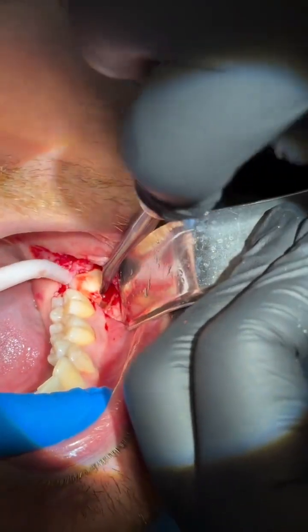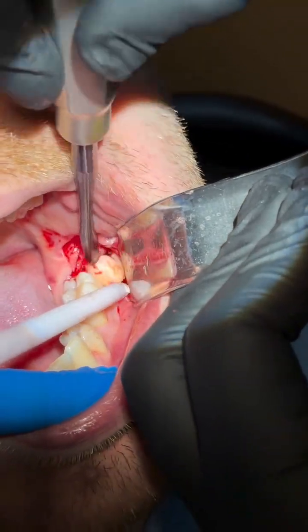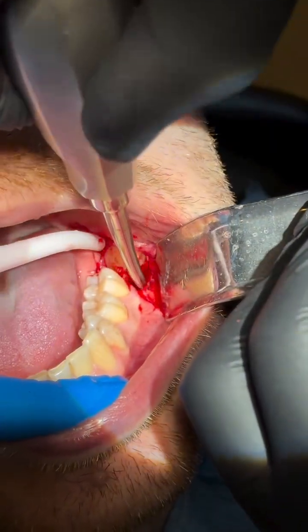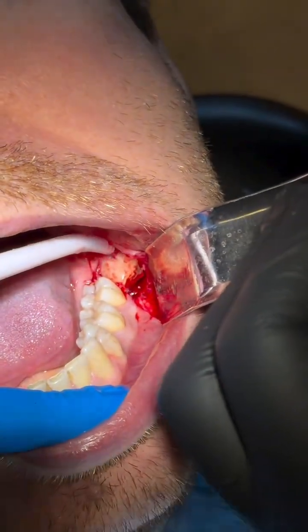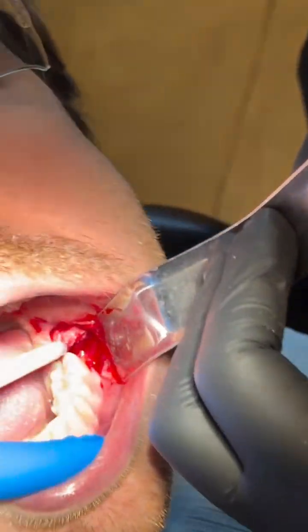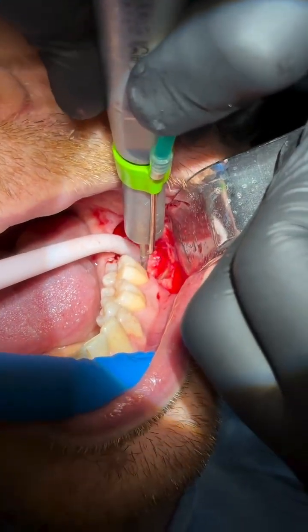Once the crown is broken, I remove the broken part of the crown. I'm using the Cryer's elevators here. I only use Cryers on special occasions. Pick up the crown and then check the cavity, make sure all the crown is gone.